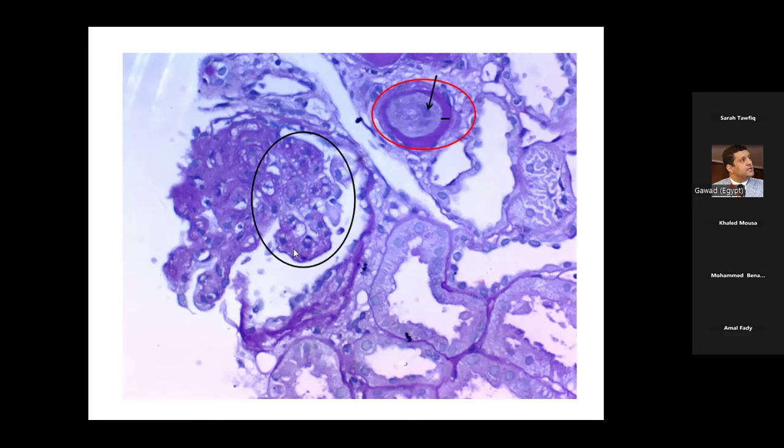Why? Because it is injured. Okay? Yes, clear. This circle is for an arteriole. This arteriole has an occluded or empty lumen. It is clear to be occluded. Can you appreciate the nucleus? That's a nucleus. It is surrounded by its ballooned cytoplasm, plus some other things.